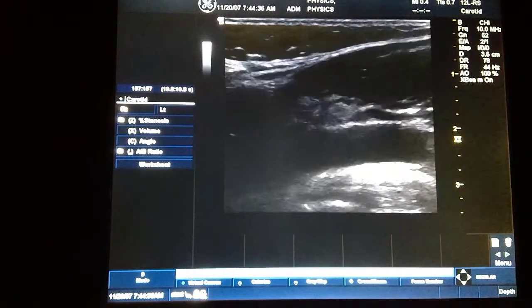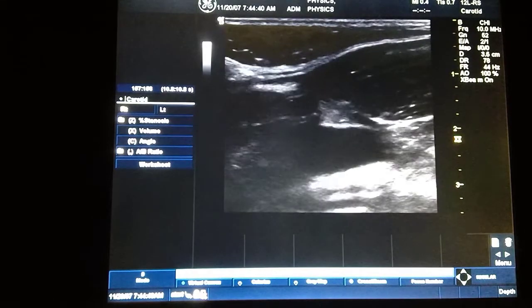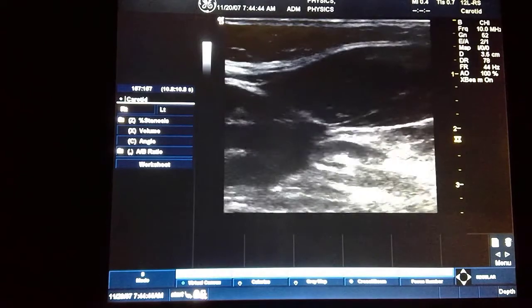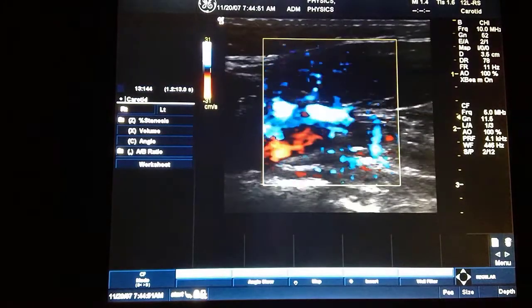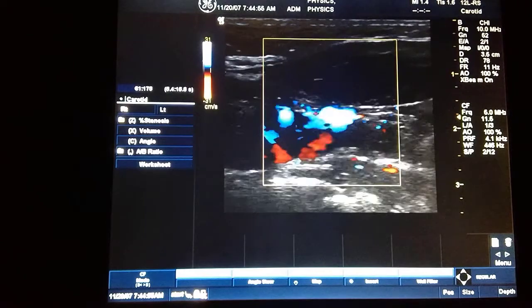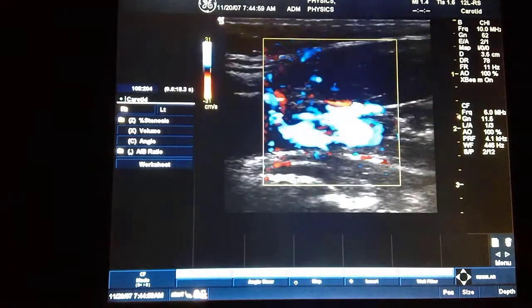Now we're talking about this in the realm of Doppler, and I'm going to turn color Doppler on. If you recall, when we are at 90 degrees, theta is 90, and the cosine of 90 is 0. It negates the whole Doppler equation. It makes it so the machine cannot figure out which direction, to or from, the blood is moving. So let's get this to 90 degrees again.